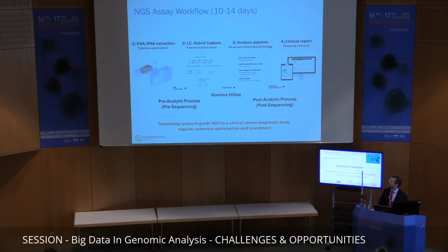And then a really important part: the job isn't done when you identify the mutations that are present. The analysis, annotation, and reporting of those mutations is critically important to give treating oncologists all the most important information right up front.